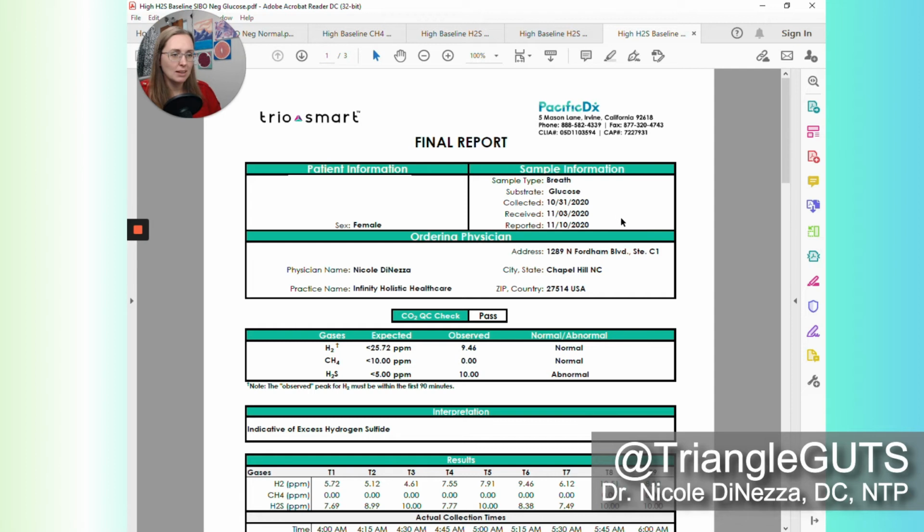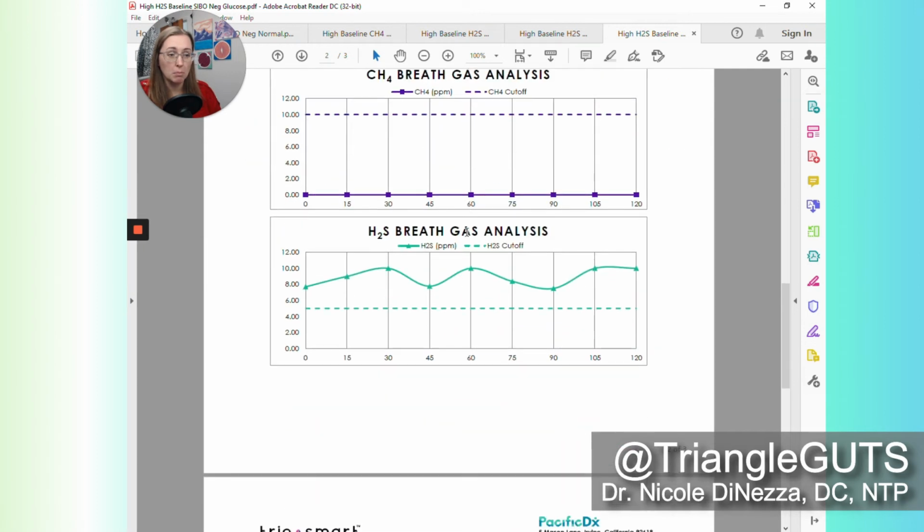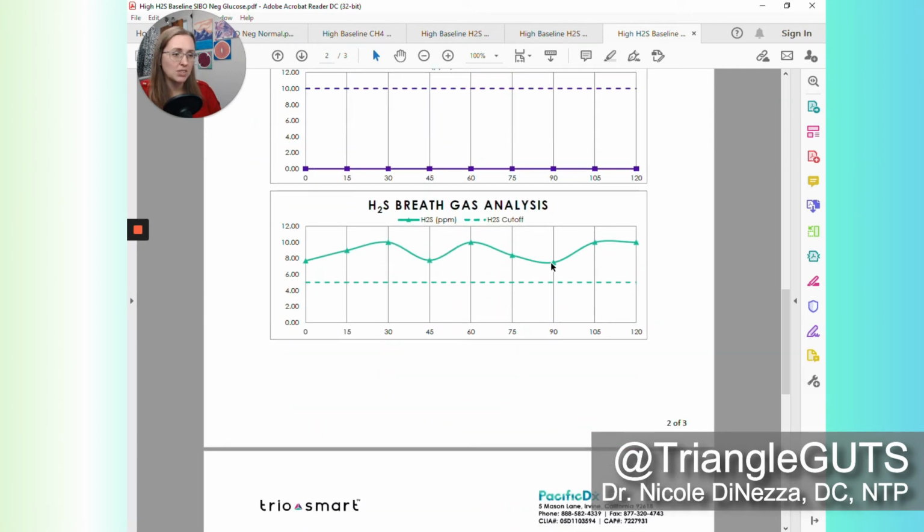So that is not necessarily necessary for the interpretation of a glucose test. We would not expect the glucose to reach the colon much at all. And yet you can see we actually have a little bit of fermentation apparently reaching, or a little bit of the sugar and thus fermentation in the territory of when we would reach the colon, which is very suspect. Glucose should be absorbed by the first part of the small intestine, so really it shouldn't be making it far beyond that.